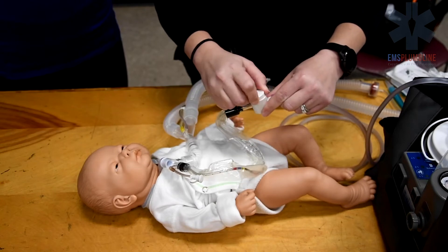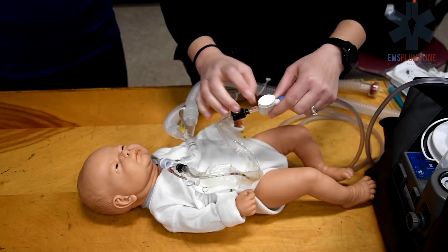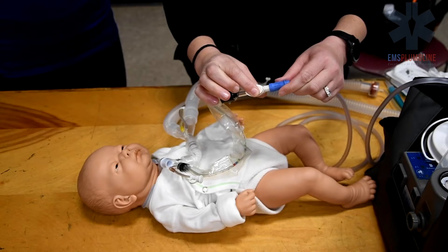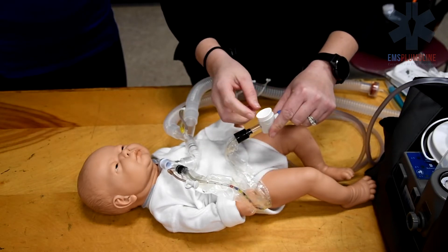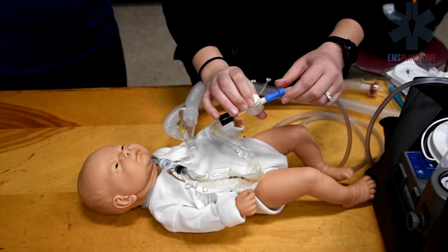Attach the suction machine tubing to the Ballard suction. Ensure the white thumb valve or suction button moves freely. Turn the oval white thumb valve to test the locking mechanism.